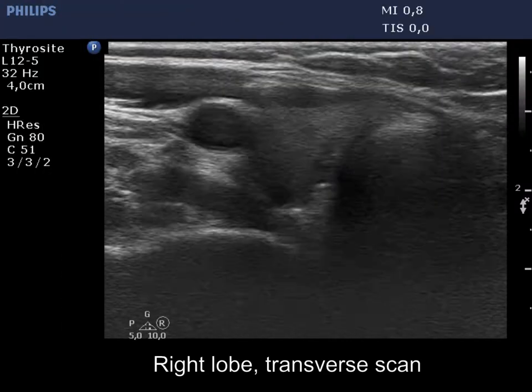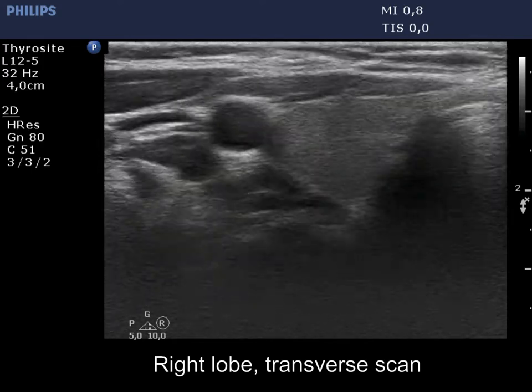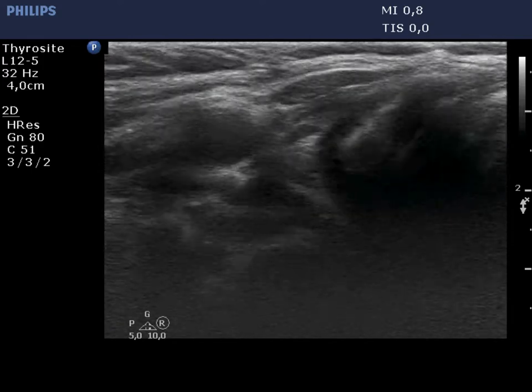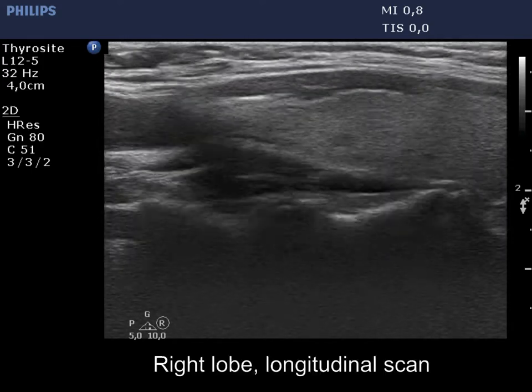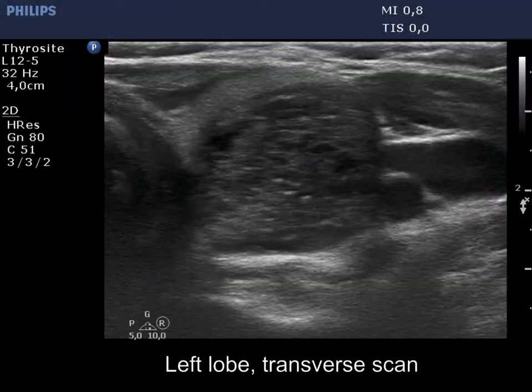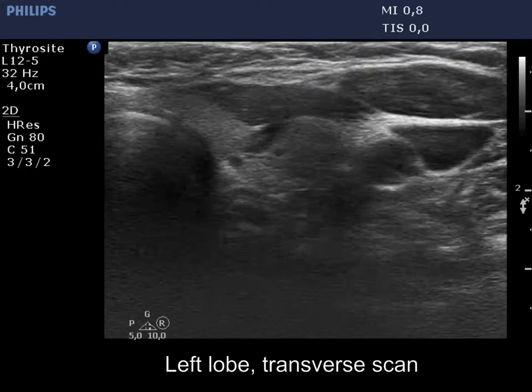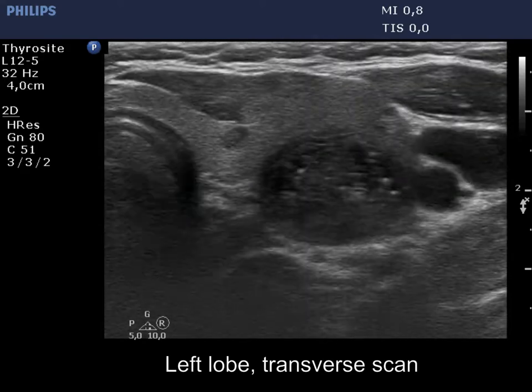The thyroid is echonormal. The right lobe has a small insignificant lesion. There is a large cystic nodule in the left lobe.